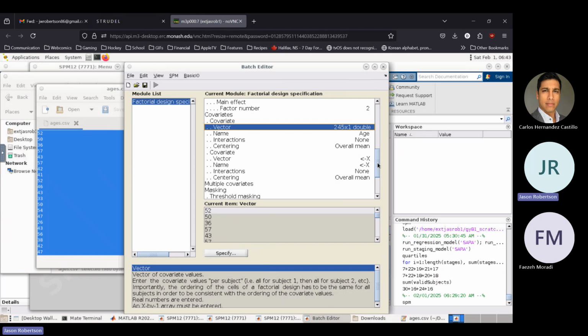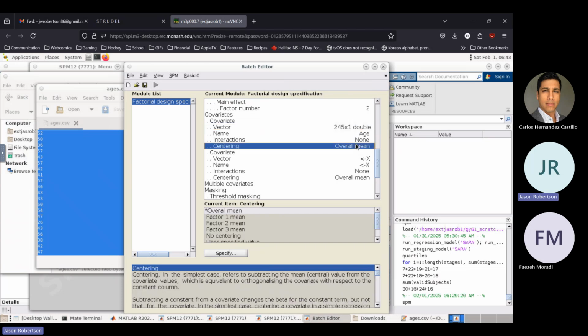Basically, the code I have is derived from this way of doing things because I have everything in a data structure.